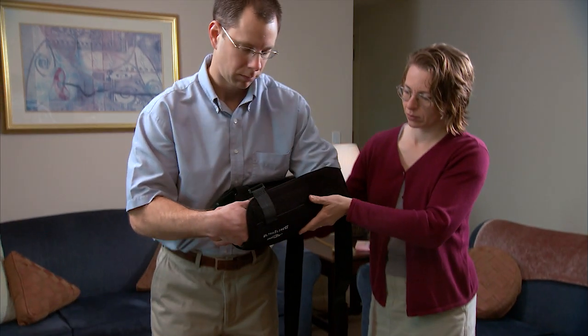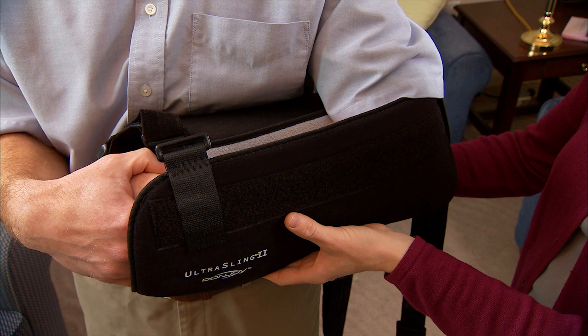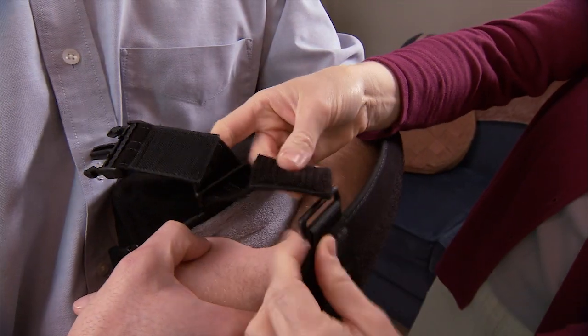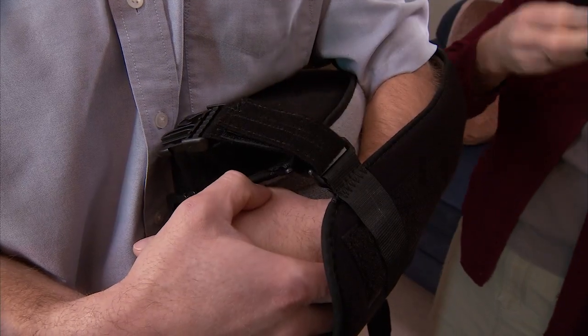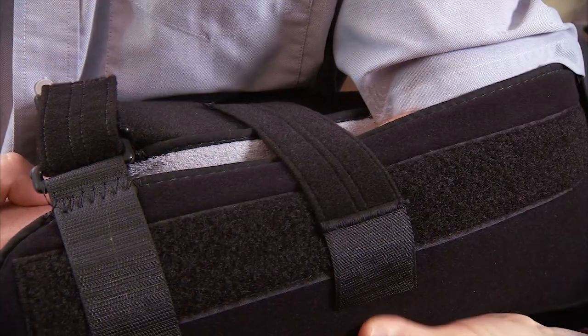Grasp your hand and gently bend your healing arm at the elbow as you straighten up. Keep your healing shoulder and arm relaxed. Let the other arm do the work. Keep the pillow snug against your body. Keep the elbow of your healing arm in front of your body. Your wrist should be at the midline of your body. Your helper puts the short strap through the plastic rings on the open end of the sling and attaches the Velcro to hold the sling closed, then attaches another short strap to close the sling around your arm in the middle.